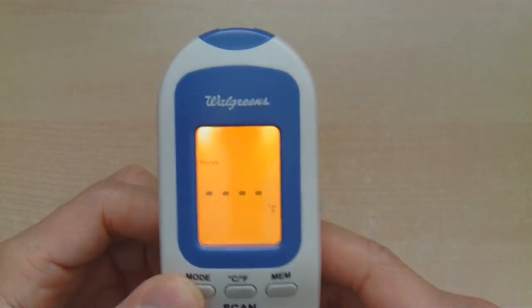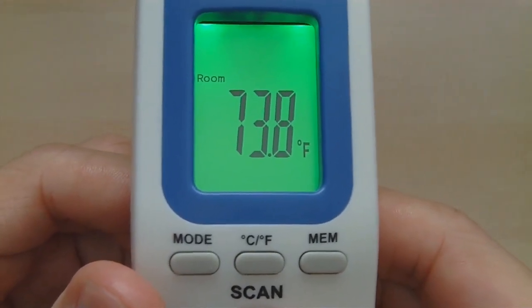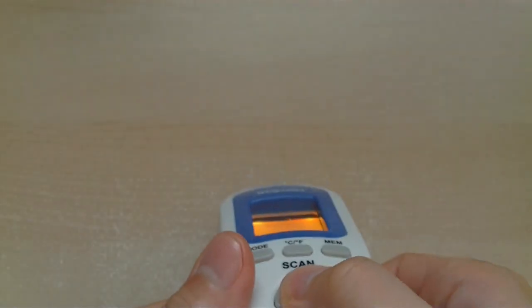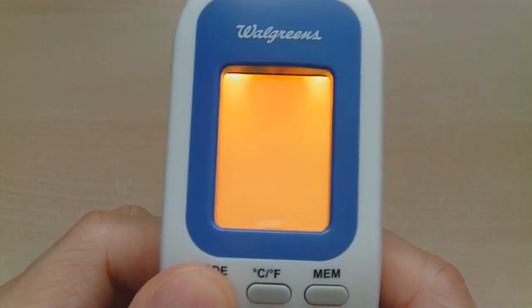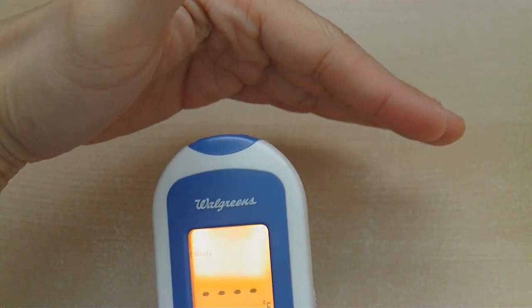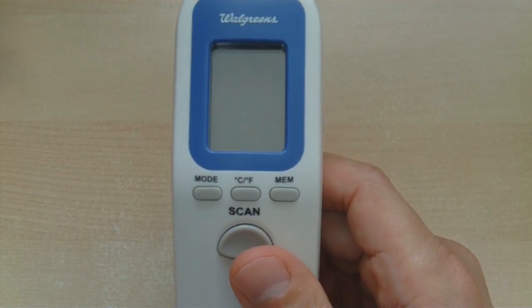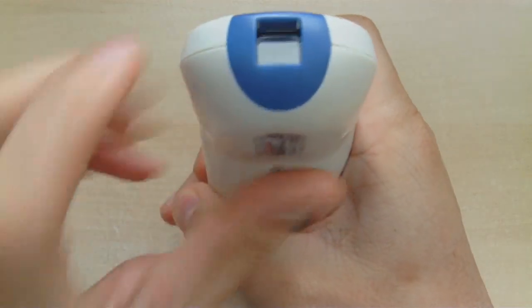If we hit the mode button it says 'room.' We hit scan and it says 73.8°F — that sounds about right for the room we're in. If we hit mode and want to scan something else, it says 'surface temperature.' We scan the desk temperature: 74.1°F, slightly warmer. If we hit mode and scroll over to body, keeping my hand a little bit away, it says 97.2°F. It did not need any contact — it read the temperature straight off with an air gap using the infrared sensor at the top.